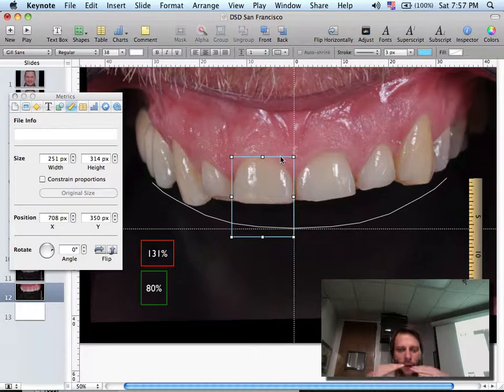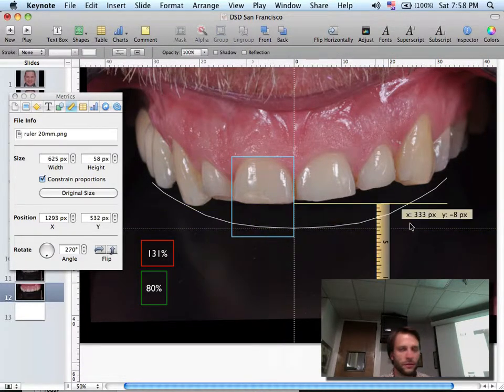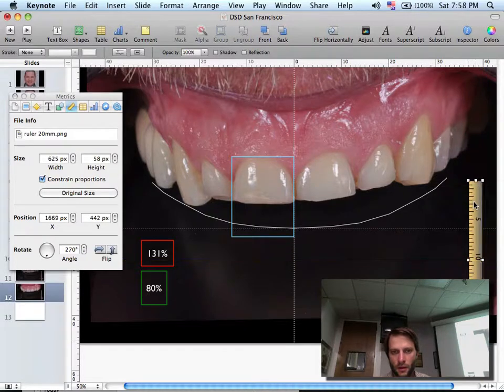So if this was a guy with a high lip line and showing the whole central, we could probably think about crown lengthening or making it longer, testing in the mouth, in the mock-up, if he could handle a longer central. Now it's probably almost 4 millimeters of lengthening. Okay? That's not a bad idea also, because he lost a lot, and we're going to open the vertical, we're going to move the lower, so we have a lot of freedom here.